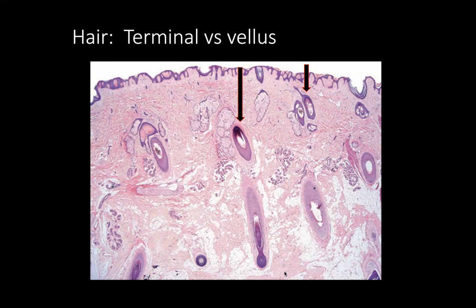That's the normal hair cycle. Catagen only lasts about 3 weeks, and that's the intermediate stage. Many diseases result in what we call an anagen to telogen shift. So the ratio goes from more anagen hair follicles to more telogen and catagen. So that shift is important to recognize.